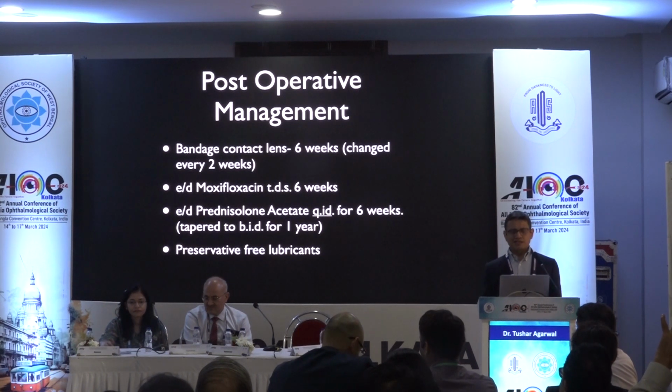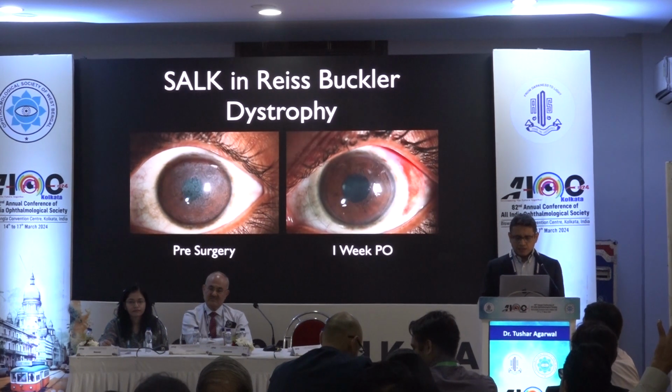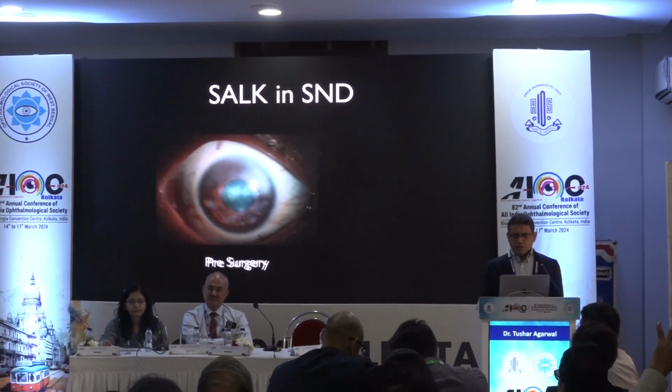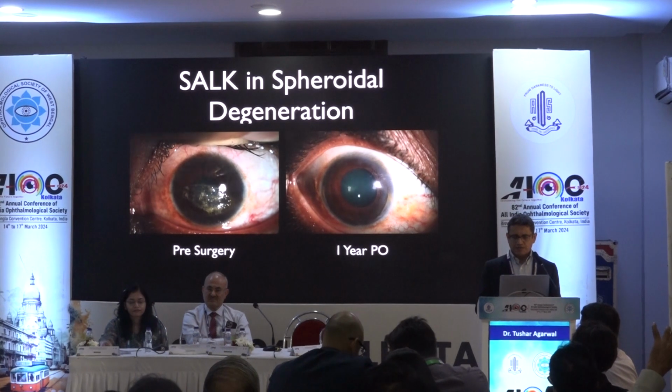Post-operatively, bandage contact lens is kept for 6 weeks. Antibiotics for 6 weeks, steroids initially a little frequently, and then tapered over a year, and preservative-free lubricants. These are a few examples of this surgery performed in various conditions. So as you can see, the graft generally clears up quite nicely after 6 weeks of surgery.